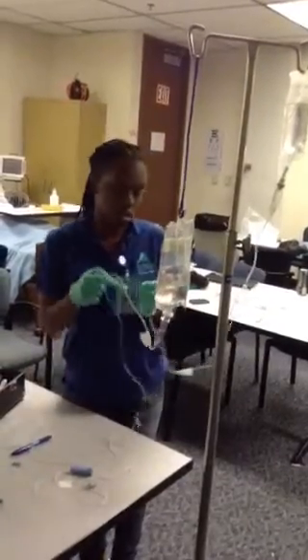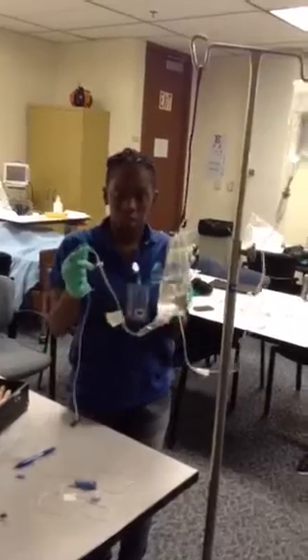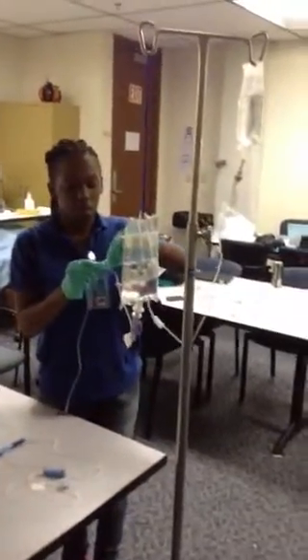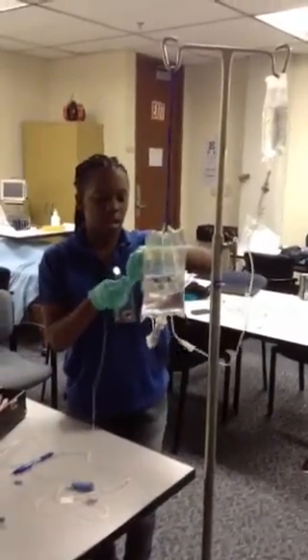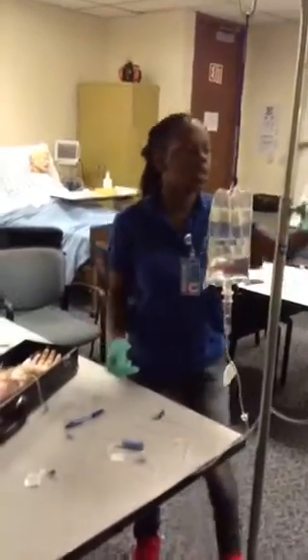I'm going to check my tubing — it's labeled, no air bubbles. I'm going to apply my piggyback here. This is clamped off. I'm going to check my flow rate, which is 17 drops per minute.